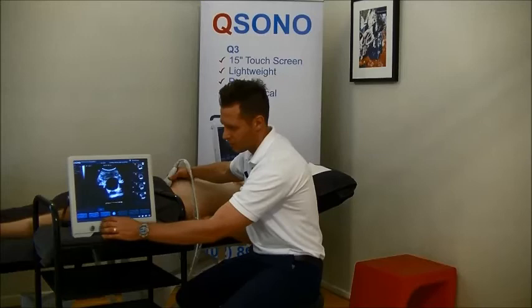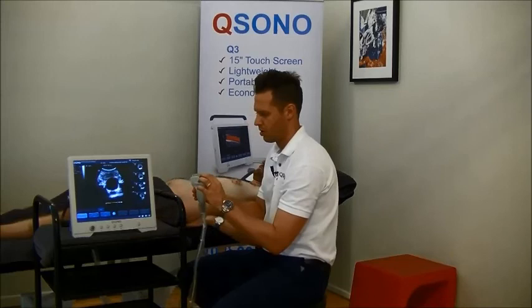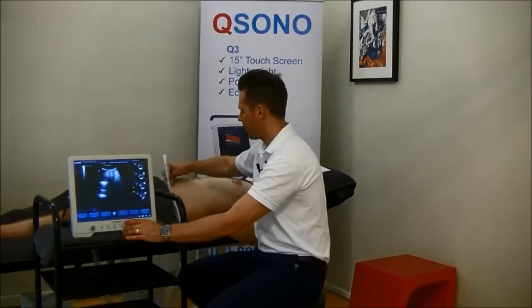Now we're going to switch to a sagittal view of the bladder. So this time we're going to have the left-hand side of the screen, or this area of the screen, where the dot is, facing towards the patient's head. We're going to go into the midline of the bladder, and we're going to angle down.